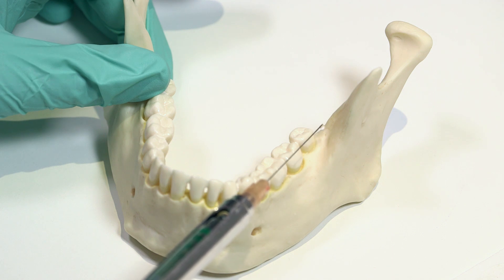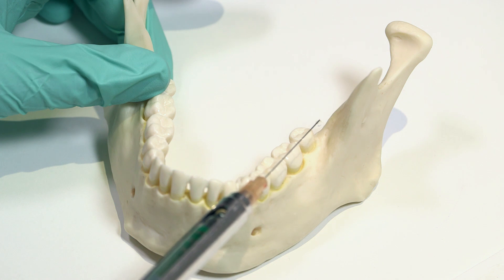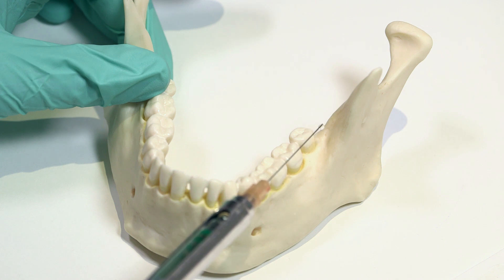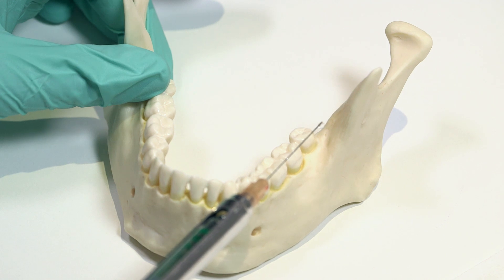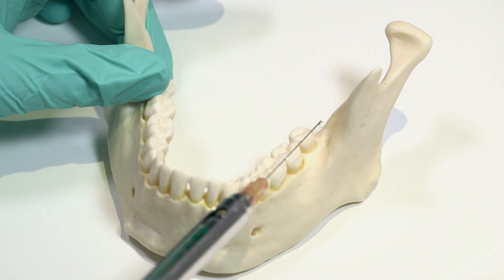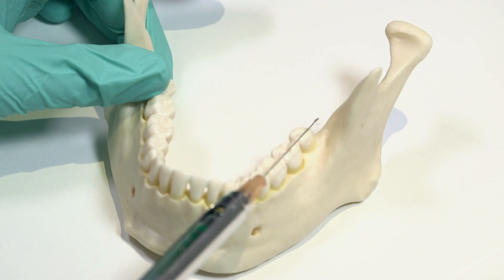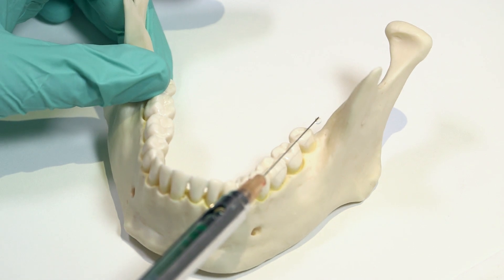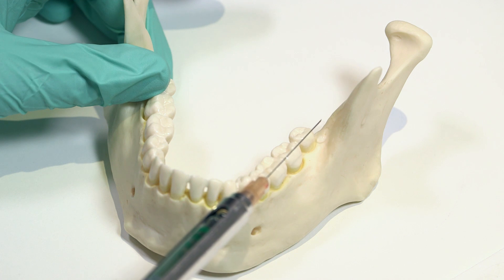The needle length may be long or short. Usually this injection is used in conjunction with an IAN block, in which case you would continue to use the same long needle. You insert the needle 2–3mm and deposit approximately 0.2–0.3ml of solution.